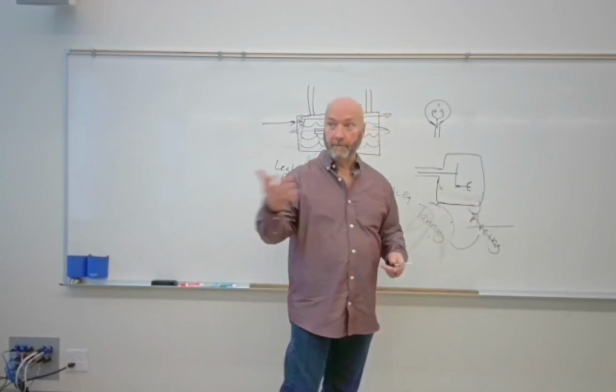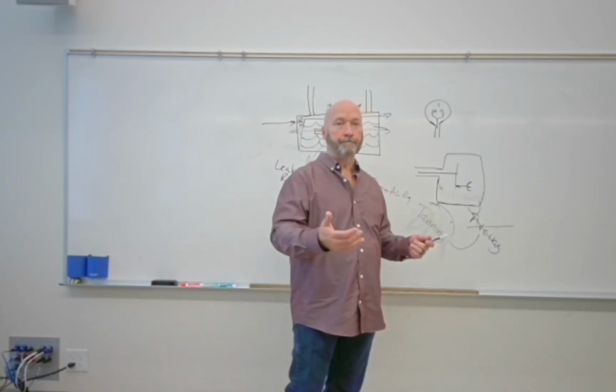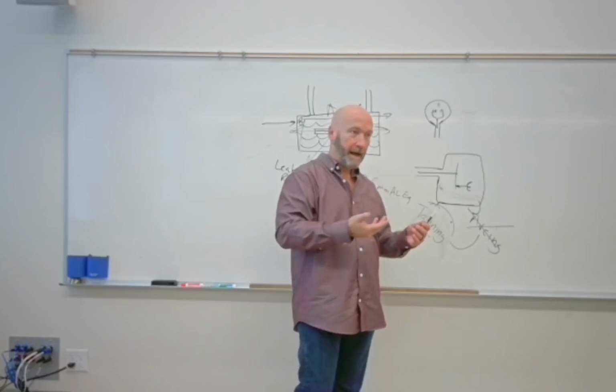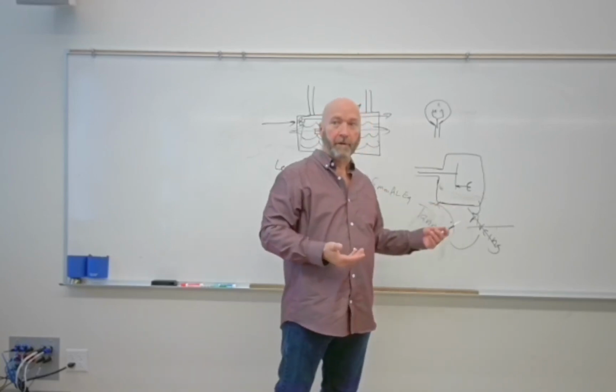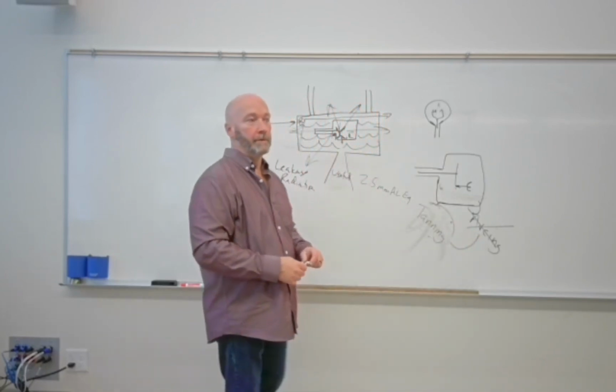So it's increased, if that is a better word to kind of sink it in, it's increased inherent filtration. Again, you can't get inside of the X-ray tube and scrub it out. It's going to be there forever until you get to a point of arcing or something else kills the X-ray tube. Okay.